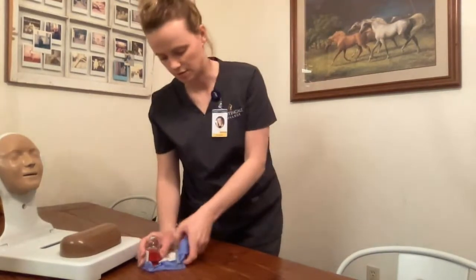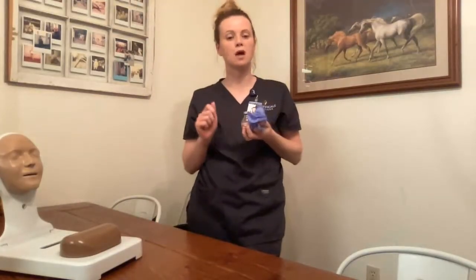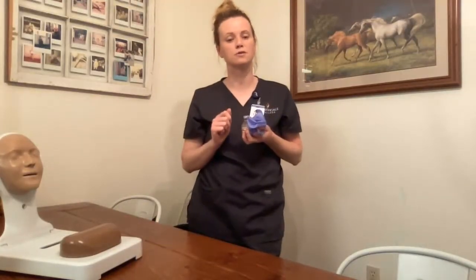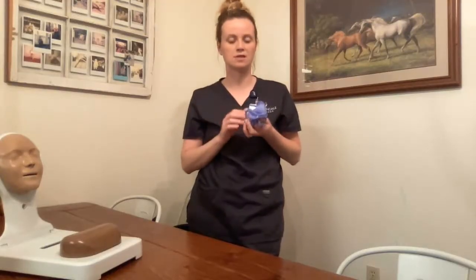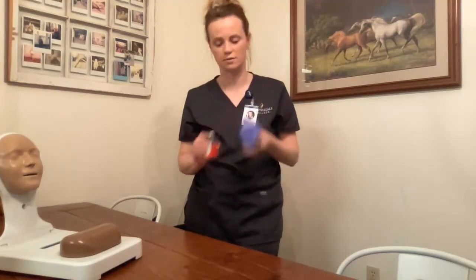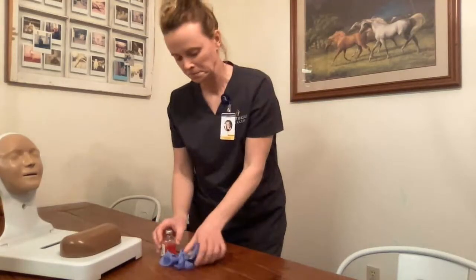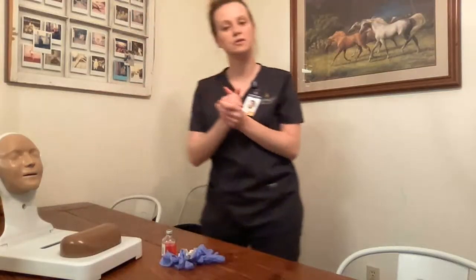I'm going to gather my supplies, head to my patient's room, knock, close the door behind me to ensure patient privacy and to avoid any HIPAA violations, and set my supplies down on a clean, dry, flat surface. I then perform hand hygiene and introduce myself to the patient.